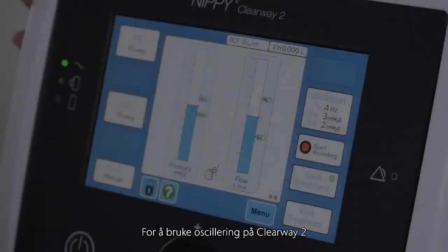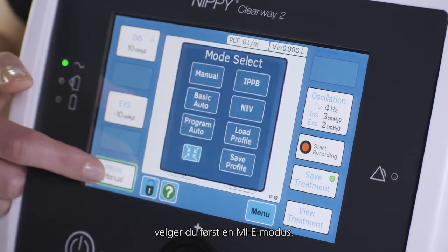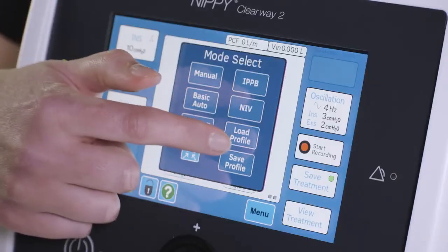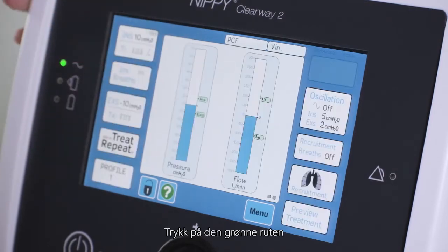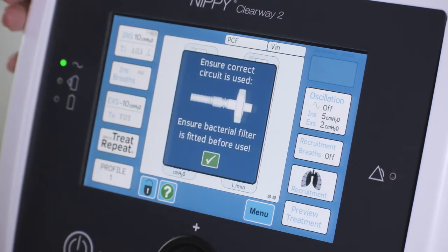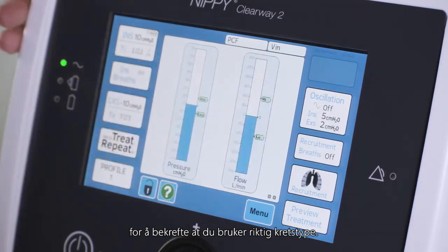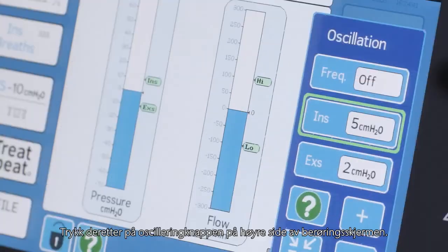To use oscillations on the Clearway 2, first select an MIE mode. Press the green box to confirm you are using the correct circuit type. Then press the oscillation button on the right side of the touch screen.